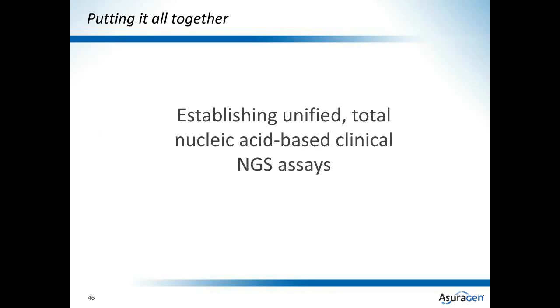Part 4, putting it all together. So in this segment, we're going to talk about how we've been able to take DNA markers and RNA markers, including novel mRNA expression markers and translocation, and marry them with a unified total nucleic acid-based clinical workflow. And I'd like to focus today on a clinical case study around thyroid cancer, but I think it's important to note that our general strategy and approach here is relevant to many different cancers and pathologies.